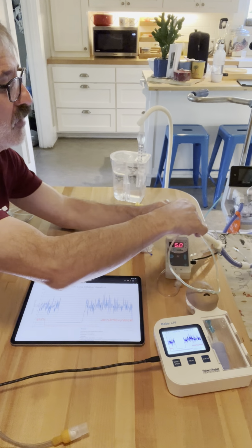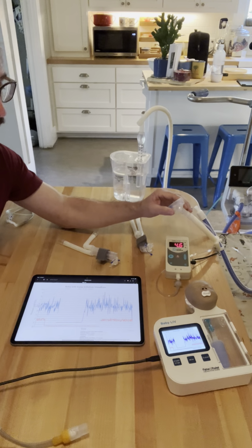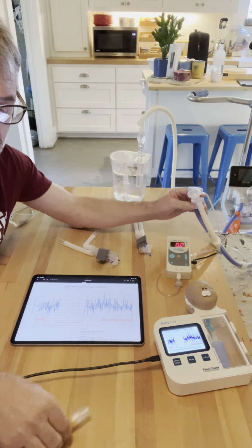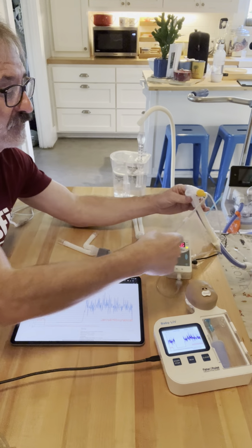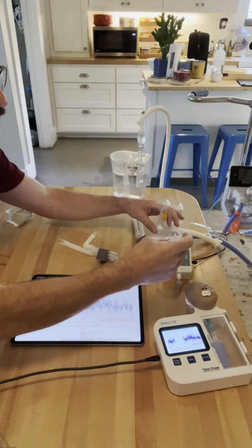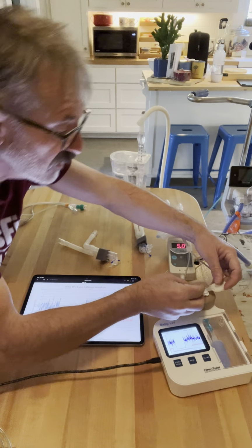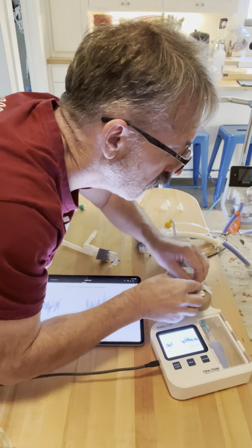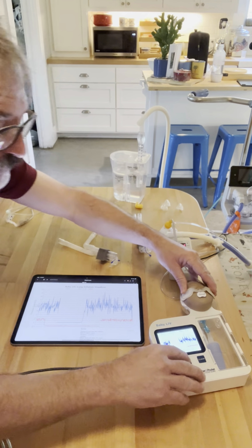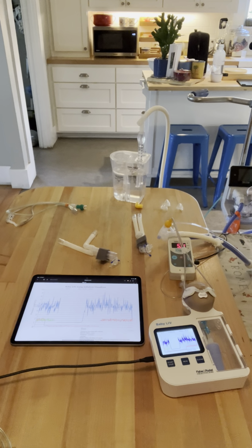What we want to do is see what happens with the green RAM versus the yellow Optiflow. So I've taken off the green RAM. I've plugged in the yellow Optiflow. It's bubbling. And it says 5 centimeters of water pressure, just like the green RAM did. Let me go ahead and plug this into the baby's nose. And it comes in the same.